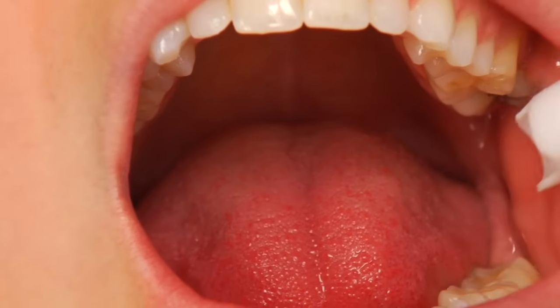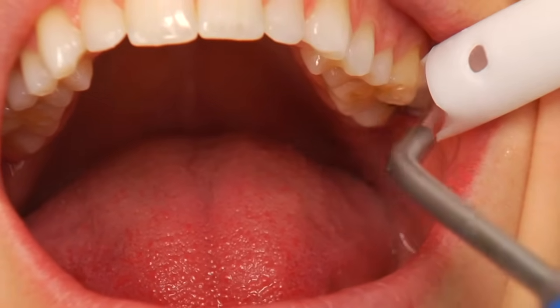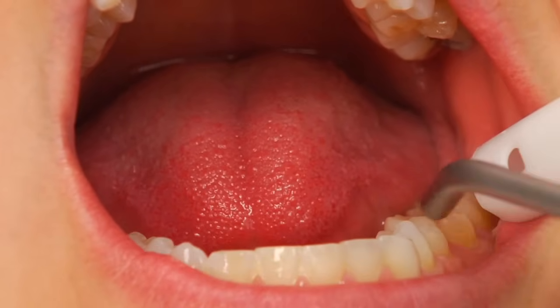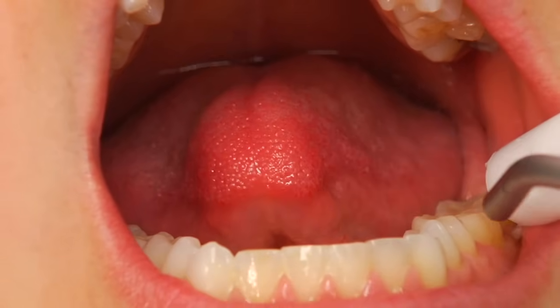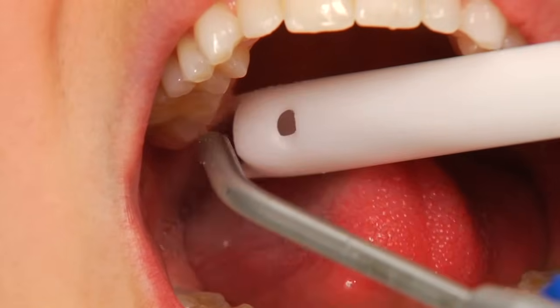When using this device, the bevel should always be held parallel to the tooth or teeth you are rinsing in all 4 quadrants. When suctioning the patient's left side, the bevel will always be parallel to the facial surface of the teeth. When suctioning the patient's right side, the bevel will always be parallel to the lingual side of the teeth.